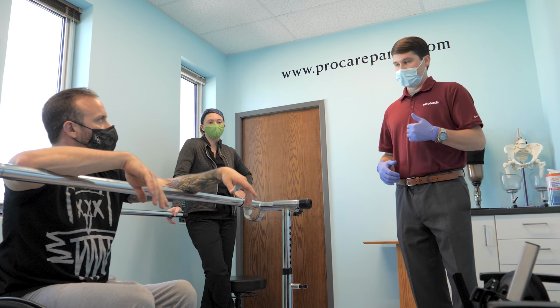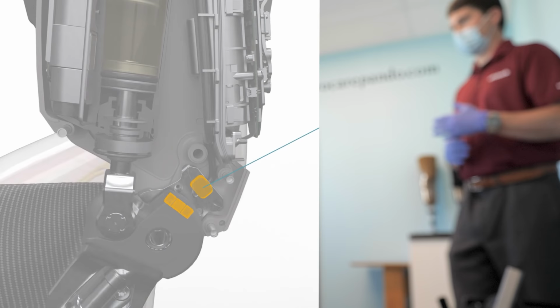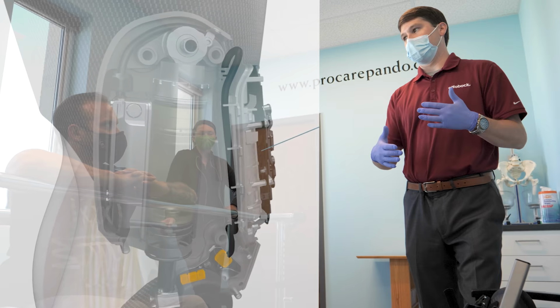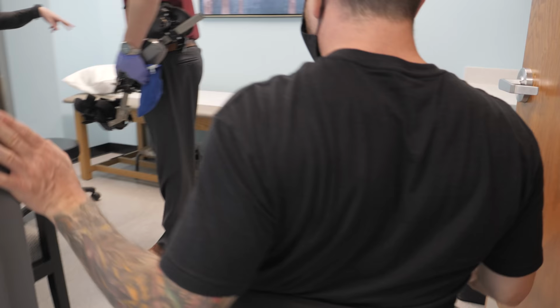So we talked about the hydraulics. The accelerometer is basically taking a picture of your knee in space 100 times a second. That's where the stumble recovery comes in, telling whether we're in normal gait, starting to stumble, or not operating the joint correctly. When your knee is straight up and down, you're going to hear a beep when you start walking. It says the joint has reached full extension and is ready to release, so you can bend and swing your leg through.